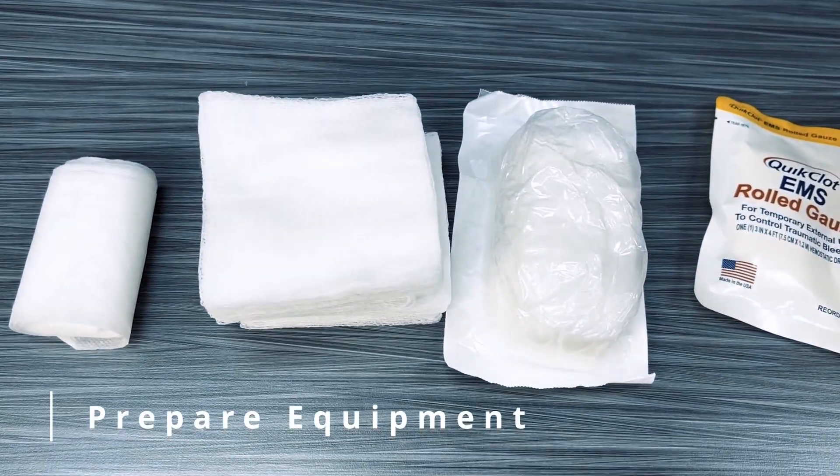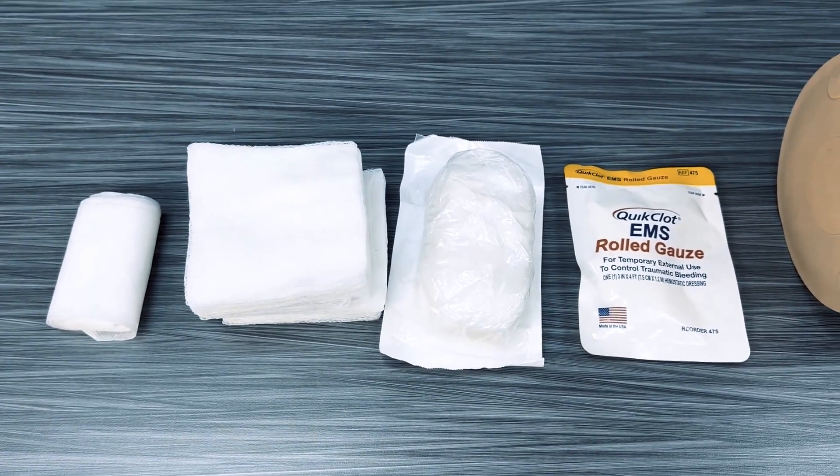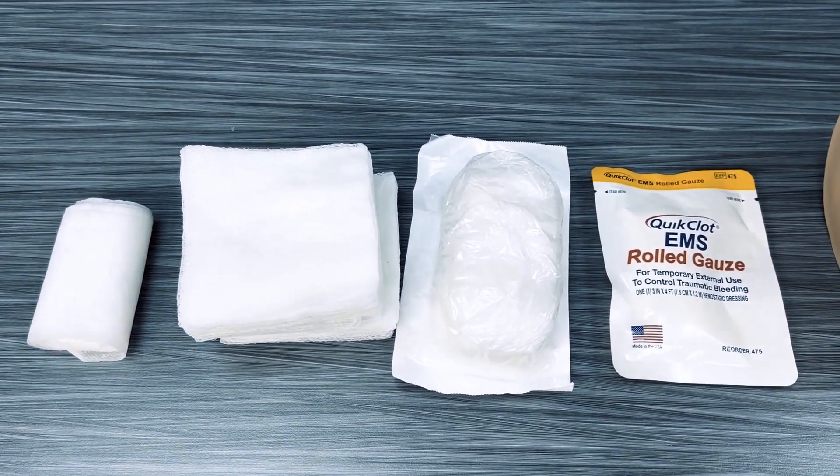Gather the necessary equipment, which includes sterile 4x4s or non-sterile if unavailable, and quick clot combat gauze.